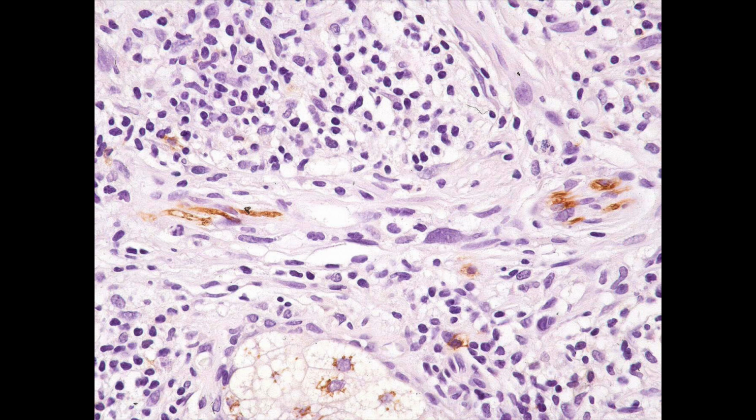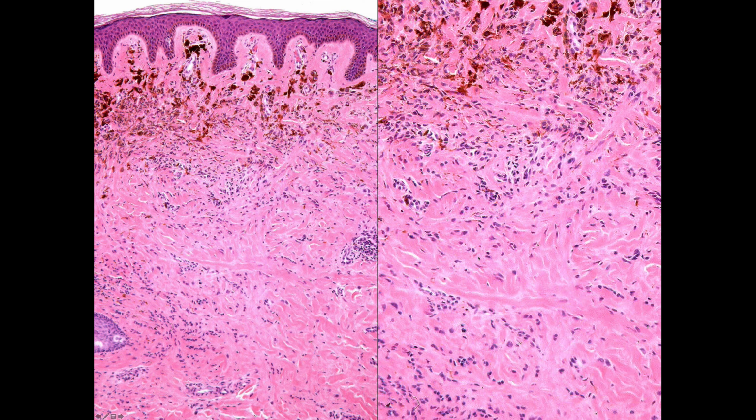And as I mentioned, desmoplastic melanoma nearly always shows neurotropism. So here's some nerve fibers infiltrated by clearly malignant tumor cells. This is all the same case. And lastly, I just wanted to draw your attention that Desmoplastic Spitz is not the only benign lesion that may show desmoplasia.